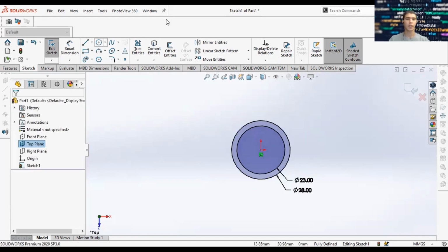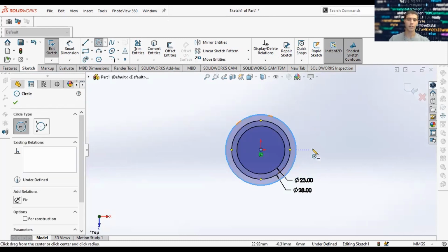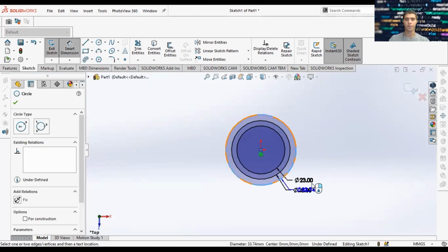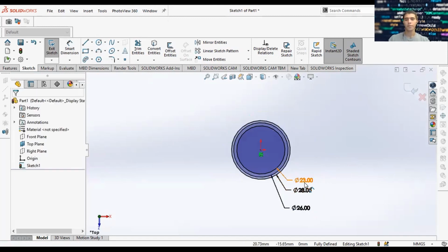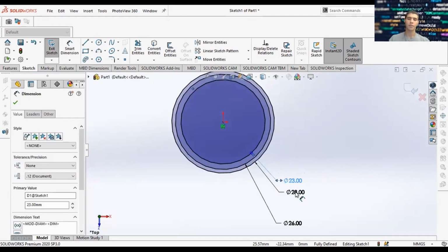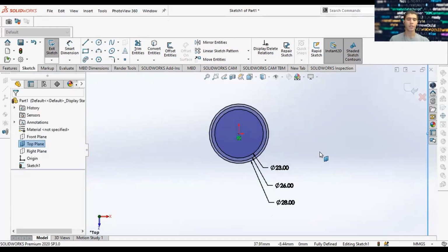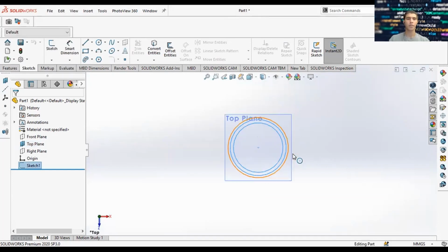And we'll throw in an intermediate one, 26, in between 23 and 28. Let's arrange them by order. And then we're good to go. So then you can press D on your keyboard to get this. Okay. Click OK. And that's our sketch for now.